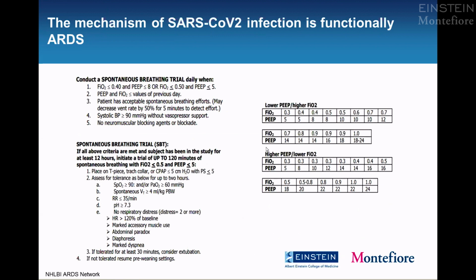And this is going to mean a couple of minutes at the bedside making adjustments. So if someone comes to you with a FiO2 of 50% and a PEEP of 10, well, looking at this, the PEEP is 10 and they're saturating okay in the mid to high 80s. Why don't I try adjusting my FiO2 and my PEEP a little bit to aim for something in the middle, maybe a PEEP of 14 and FiO2 of 40%. Give it a couple of minutes, see what they do saturation-wise. If they're saturating in that goal that we set of 92 to 96%, you might be okay. Get a gas. Maybe set it at that for the next couple of hours or until the next morning.